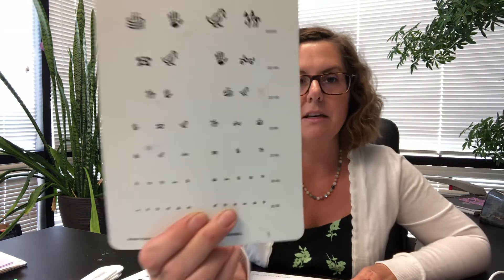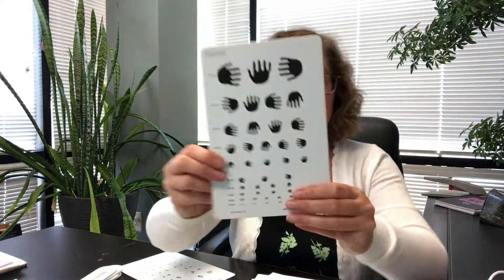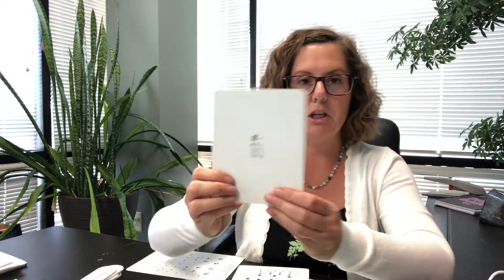Now these can all be used to assess your child's visual acuity. But as you can imagine, having them identify whether they can see a picture, or broken wheels versus solid wheels on a car, or a hand, or the letter E — that is quite a lot different than when we measure their visual acuity using a letter eye chart.